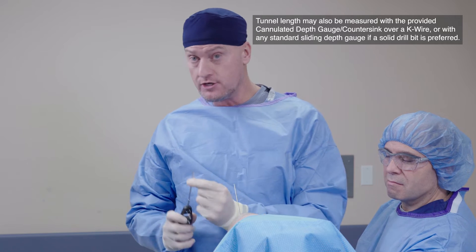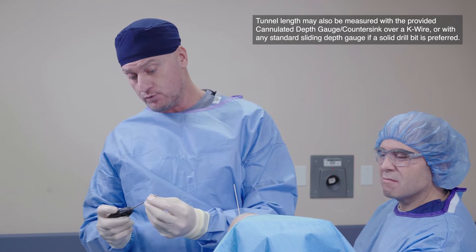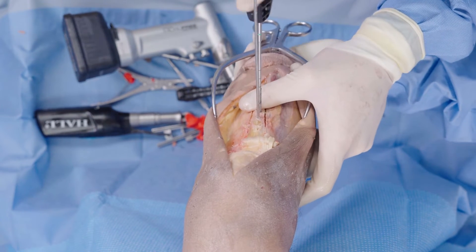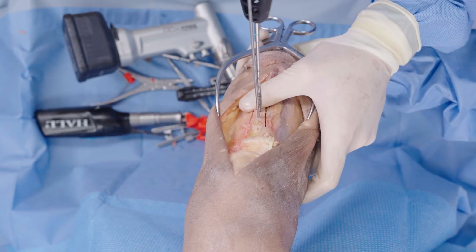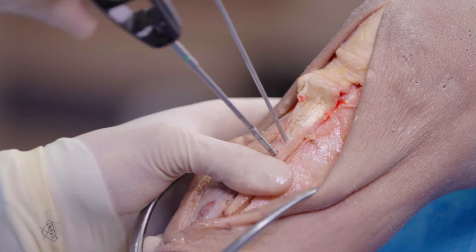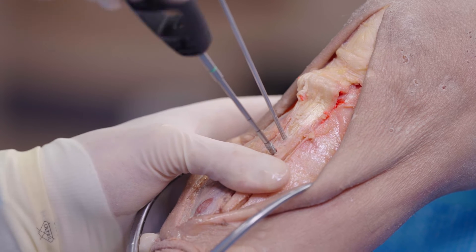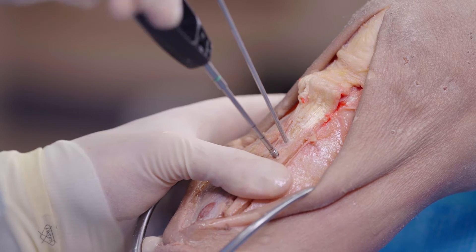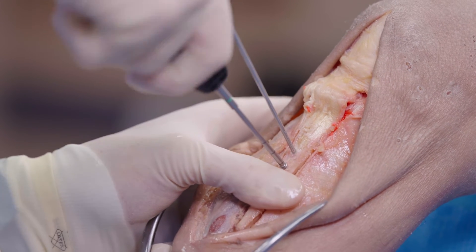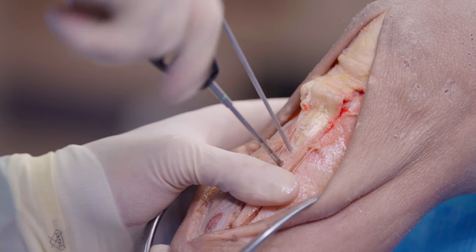Conversely, you can also use a regular depth gauge if you're more comfortable with that. The nice thing about this tap is we can get to the point. I would make sure I'm in the right spot under fluoroscopy. Once you get it started, the benefit of doing this by hand and not with power is that you can feel that far cortex a little easier — whereas under power, sometimes you can't feel where you're coming out on that second cortex.